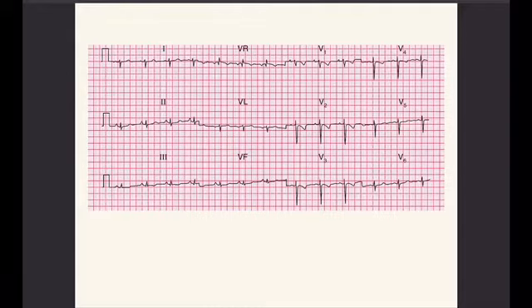That's the science behind bodybuilding. More resistance, more breaking of the muscle and regeneration of the muscle, and that creates hypertrophy of the body. So the same mechanism works here. The more force required to pump the blood, the more will be the hypertrophy of the ventricular muscles. So pulmonary embolism will also show the features of right ventricular hypertrophy. And what we can see here is sinus tachycardia. Sinus tachycardia can be seen here. So let's see.